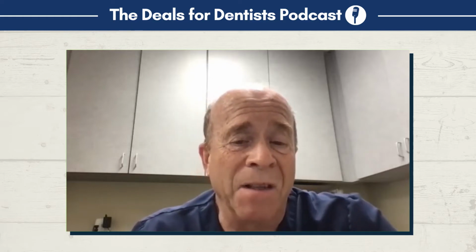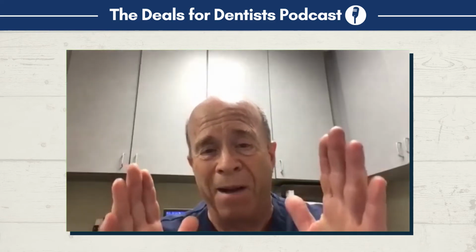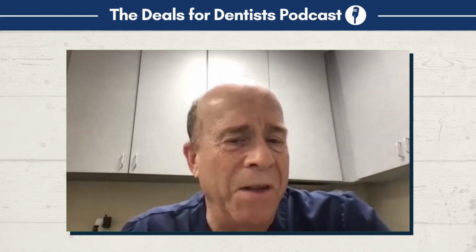My accuracy goes from 8 degrees off to 2 degrees off, and then I can miss the nerve every time, and I can put the implants in straight up and down and parallel them and not have them too close together, or too close to teeth. It's interesting. I started doing that in 2015.